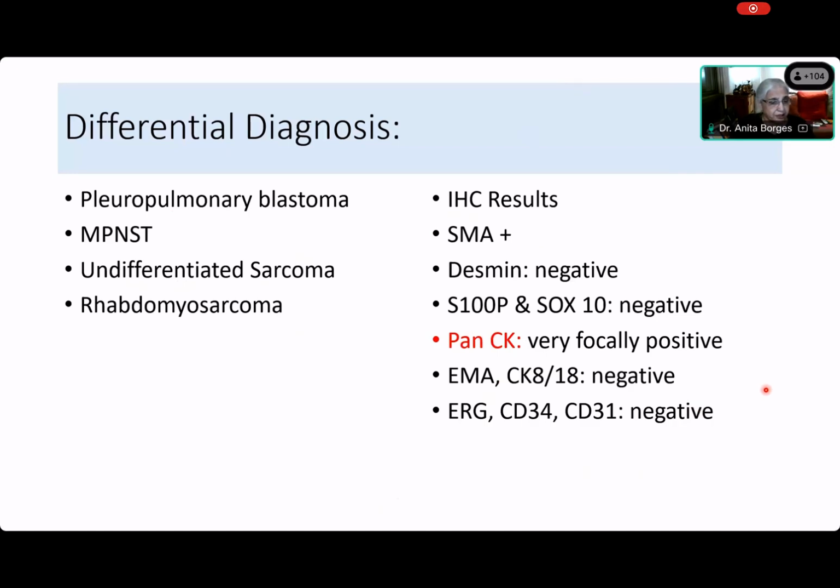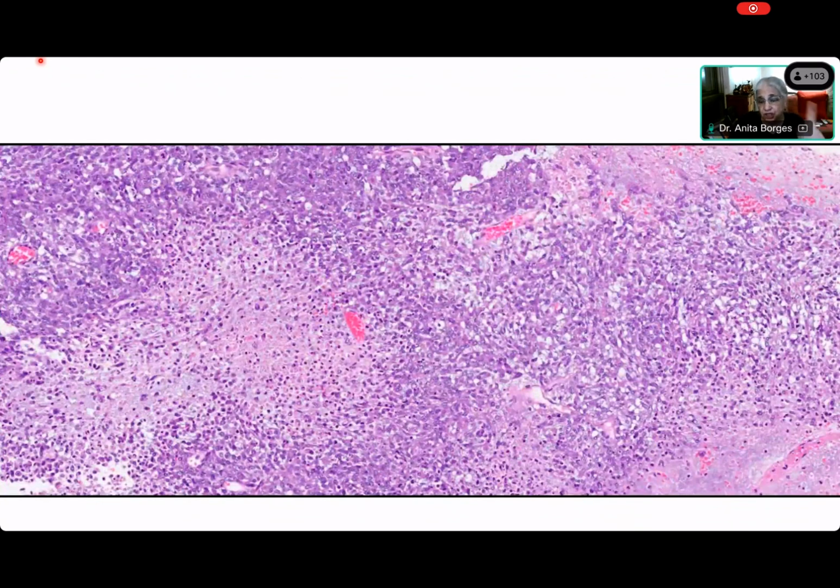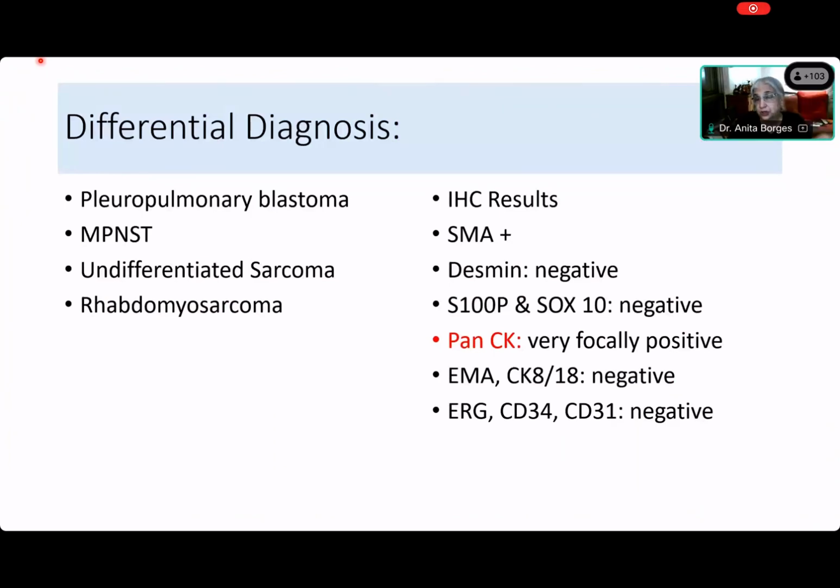Okay. Aditi, is Aditi there or she's left? Diksha, can this be a synovial sarcoma? No, ma'am. Why? Lot of necrosis. Because there is huge amounts of necrosis. And look at the mitotic activity. Now, synovial sarcomas, however cellular they are, just do not show mitotic activity. And we said that. So this is something that you have to realize about synovial sarcomas. So it can't be a synovial sarcoma.